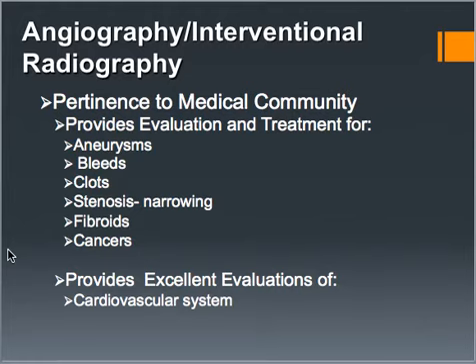And then for cancers, they usually use that to cut the blood supply from a tumor, and they can also heat and destroy cancerous cells in there. So they can use those guide wires to get right up close to those cancerous cells, and then they can heat them up and destroy them.